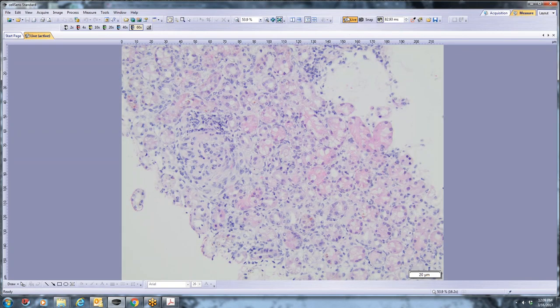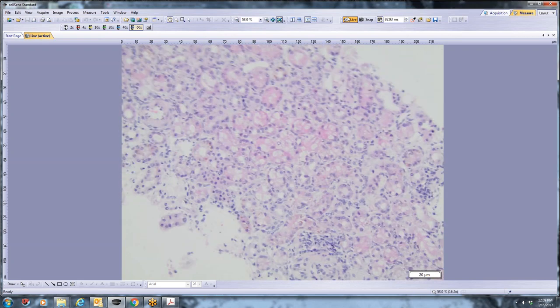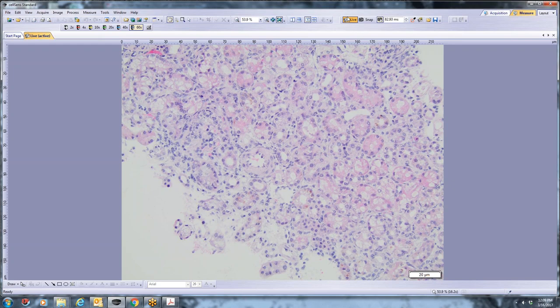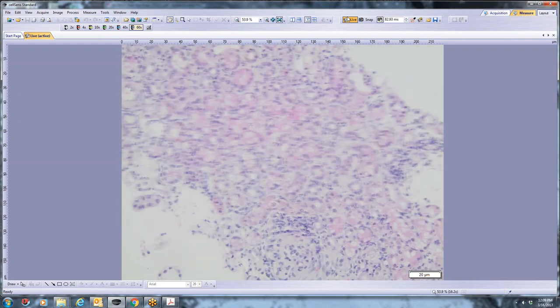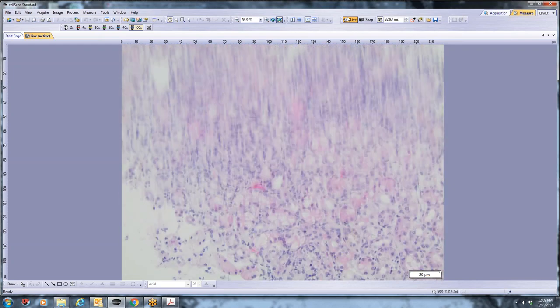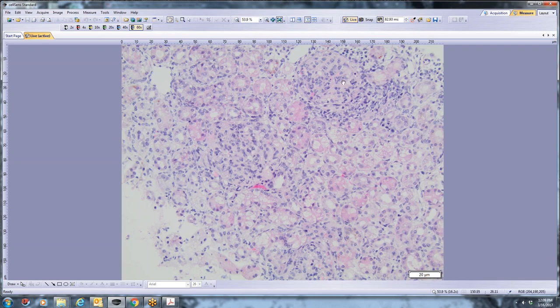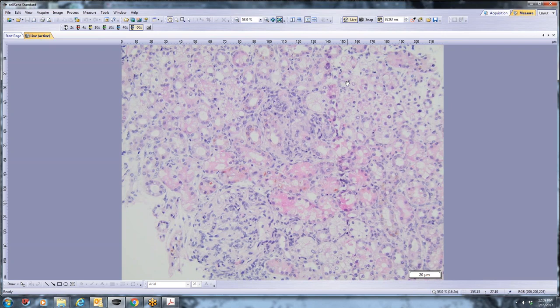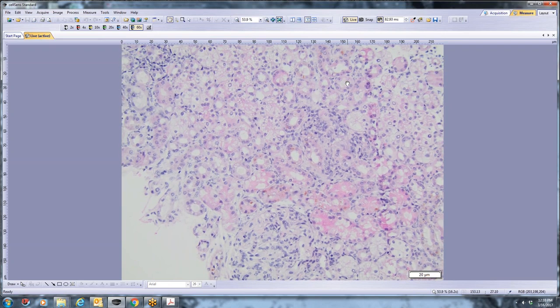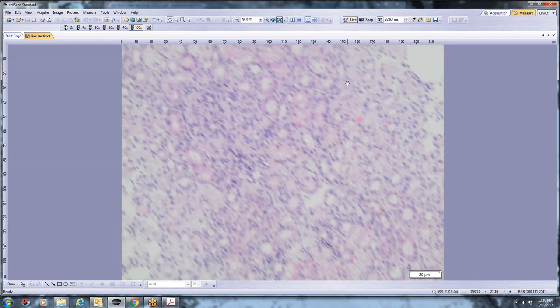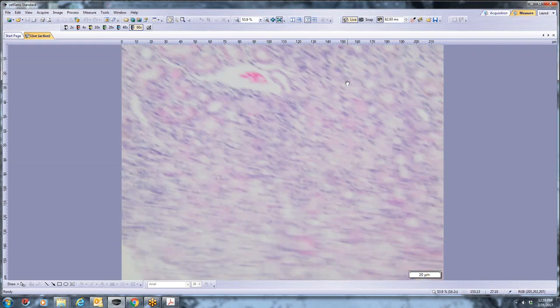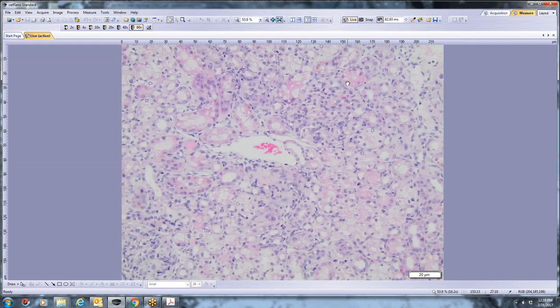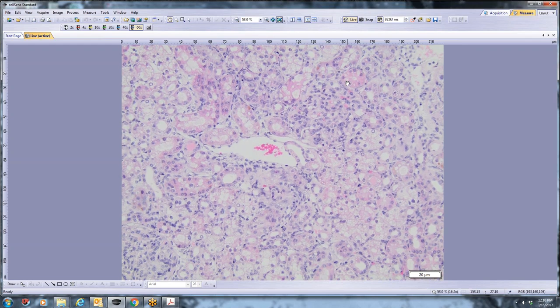The key point of looking at this particular case is the marked hypercellularity of the glomerular tufts. Sometimes they're even hard to pick out because they're just this ball of cells that are almost intermixed with interstitial inflammation. It's really even hard to find good blood-filled glomeruli just because they're so hypercellular with nucleated cells instead.